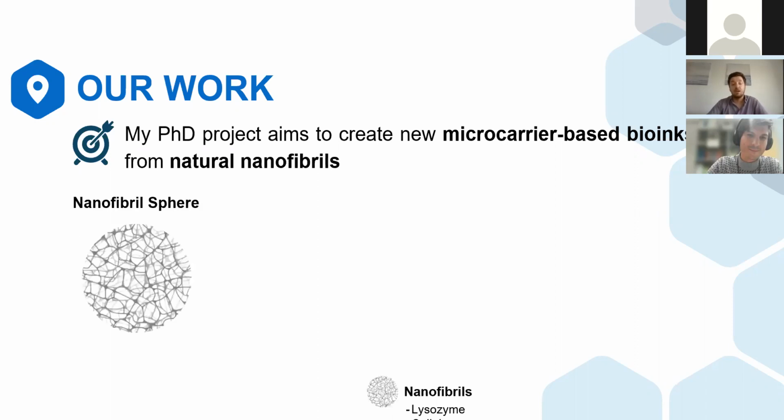As I told you before, to look closely at microcarriers. Microcarriers are little microparticles that will serve as a scaffold for cell adhesion for 3D bioprinting.